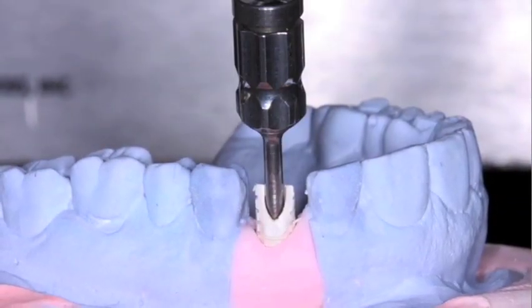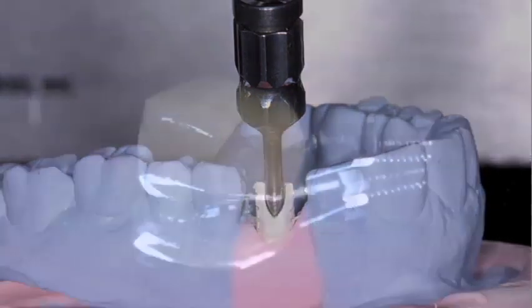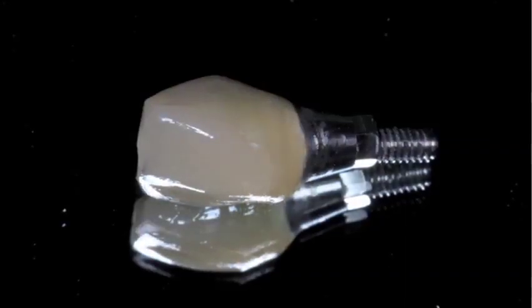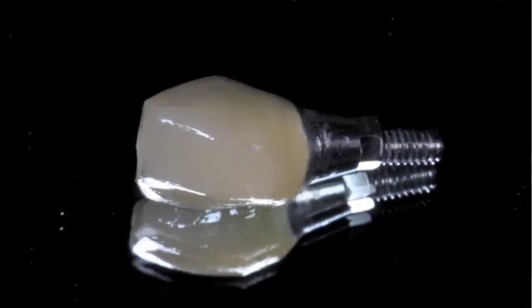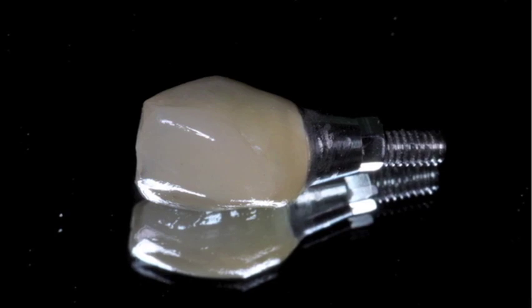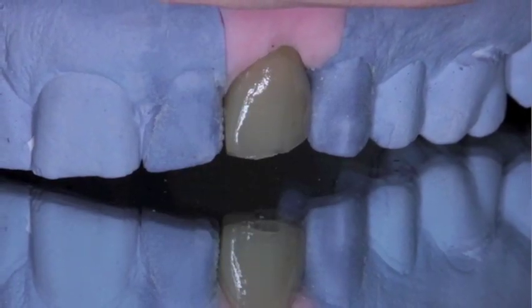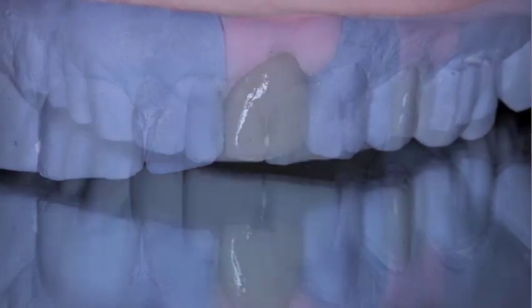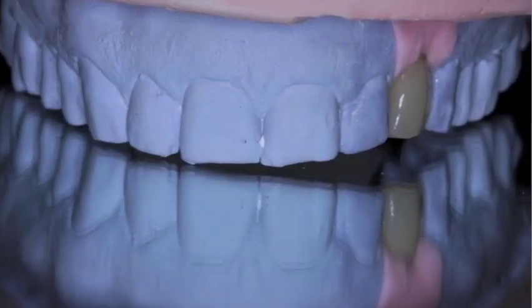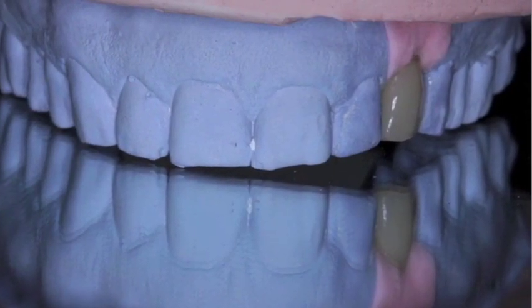At this point we can actually fabricate the prosthesis, whether it's a temporary or the final. In this case we chose to do a temporary — a temporary abutment with a provisional material. Here's the provisional itself; it's a screw-retained prosthesis. This will be placed the day of surgery. So without further ado, let us begin the surgery.